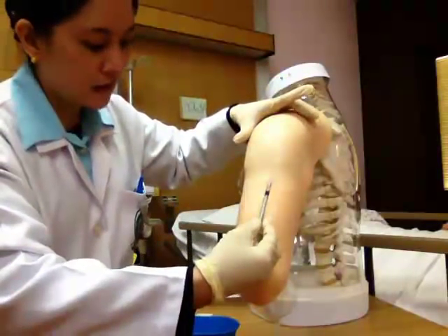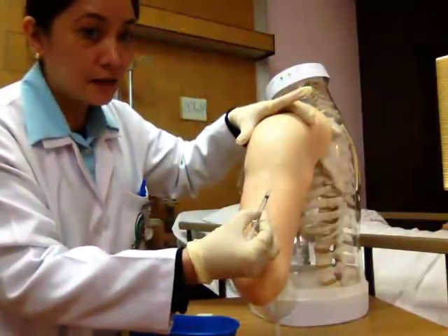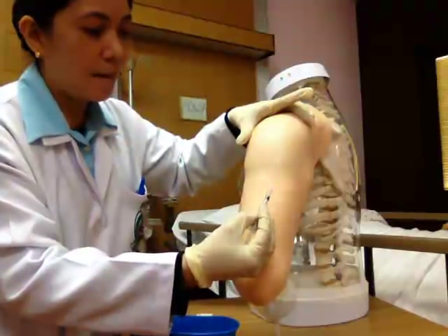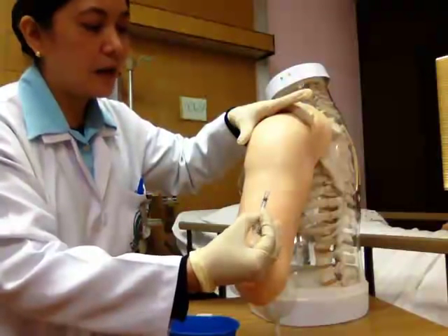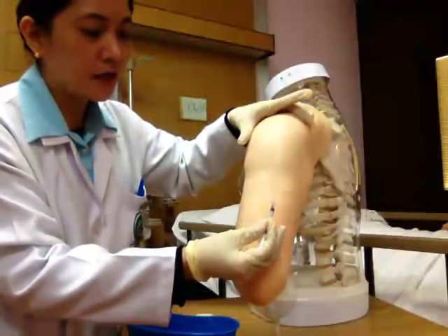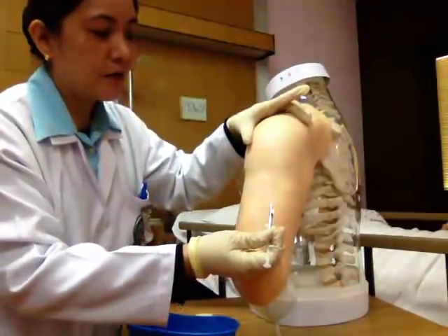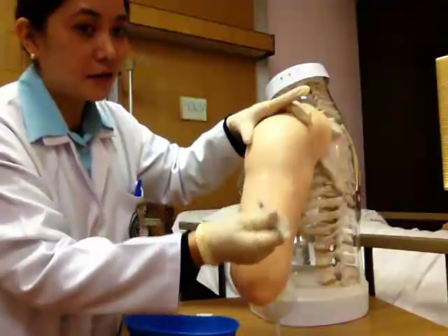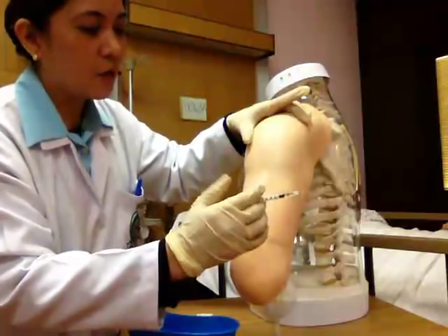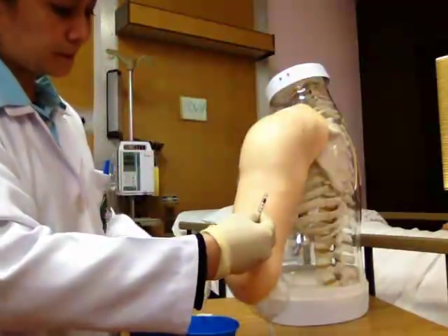Okay, get your insulin syringe with medication inside. Use an angle of 45 degrees if the patient has just a moderate body build. But if your patient is big, having a big body, then you can do it at a 90 degree angle. So here I'm going to show it to you at a 45 degree angle.